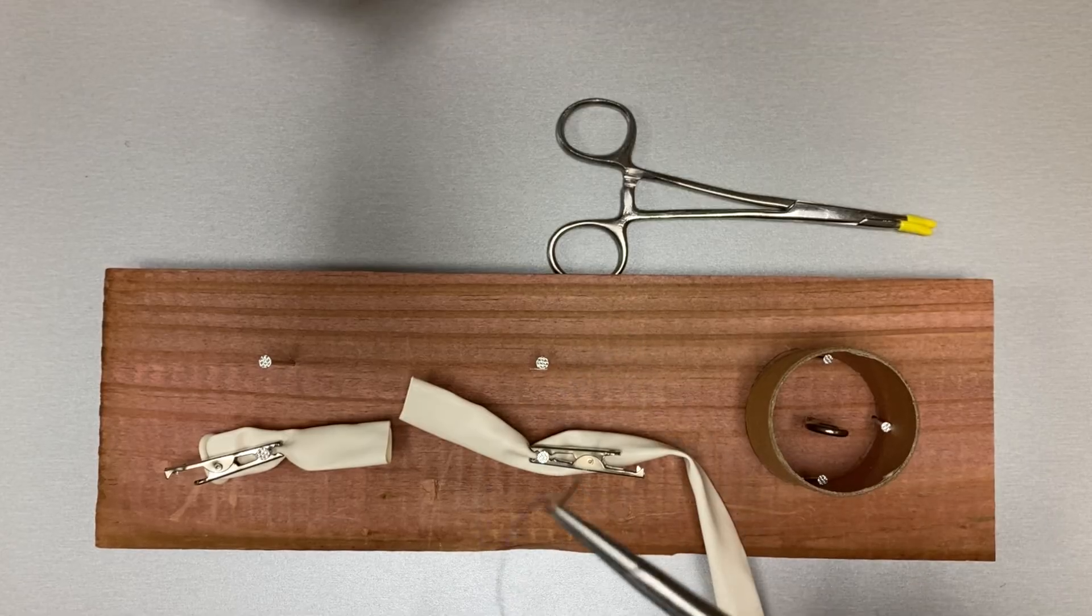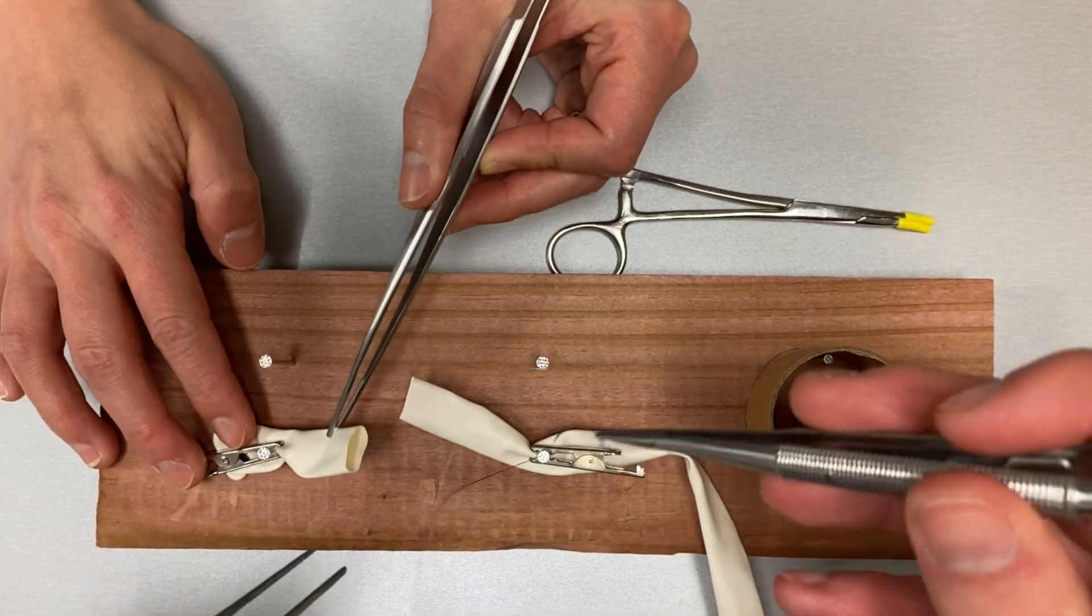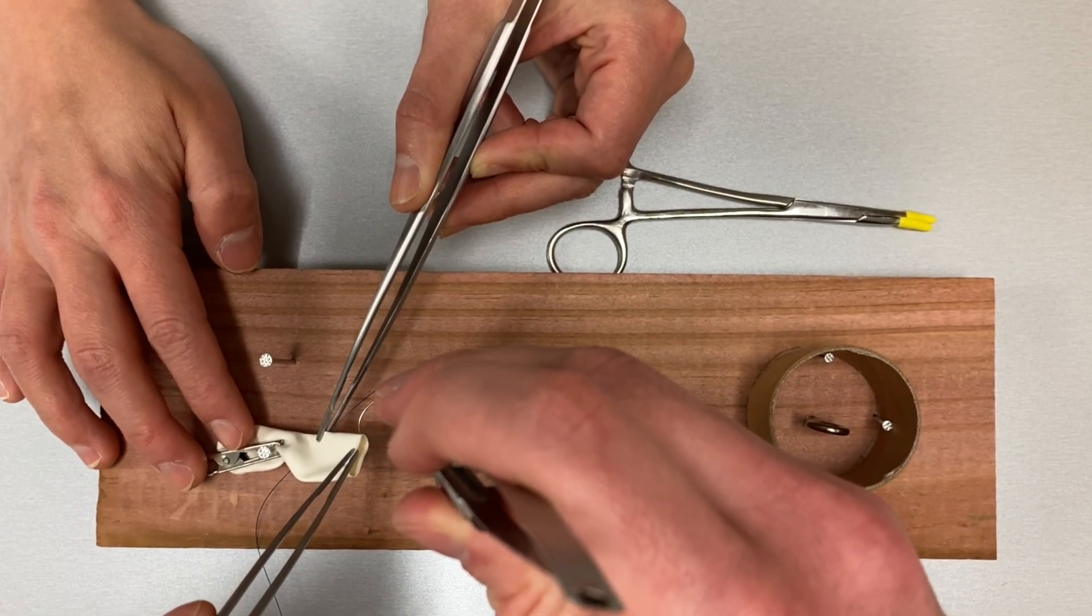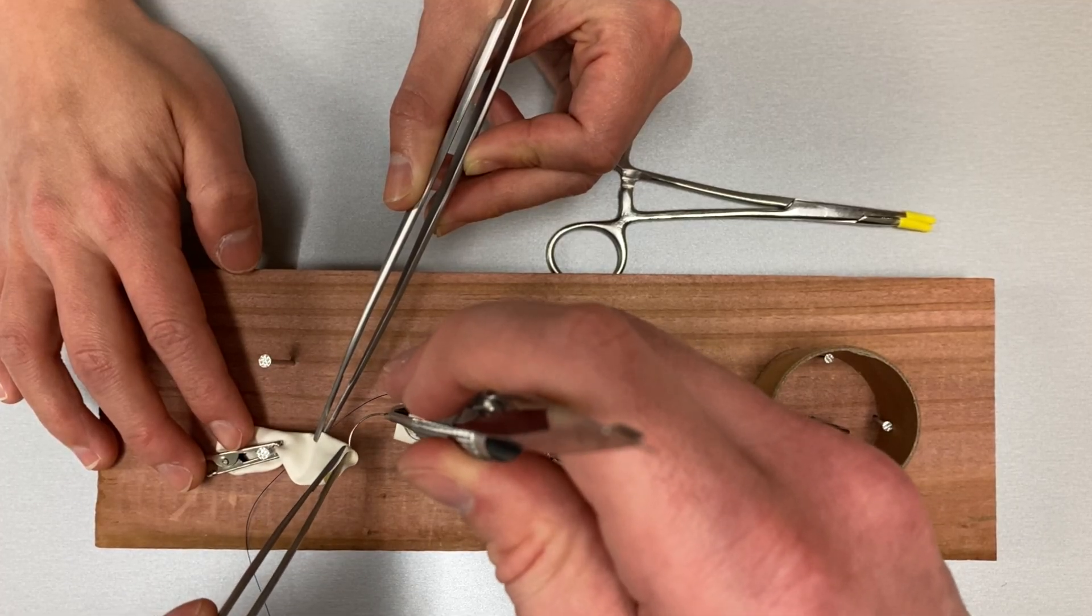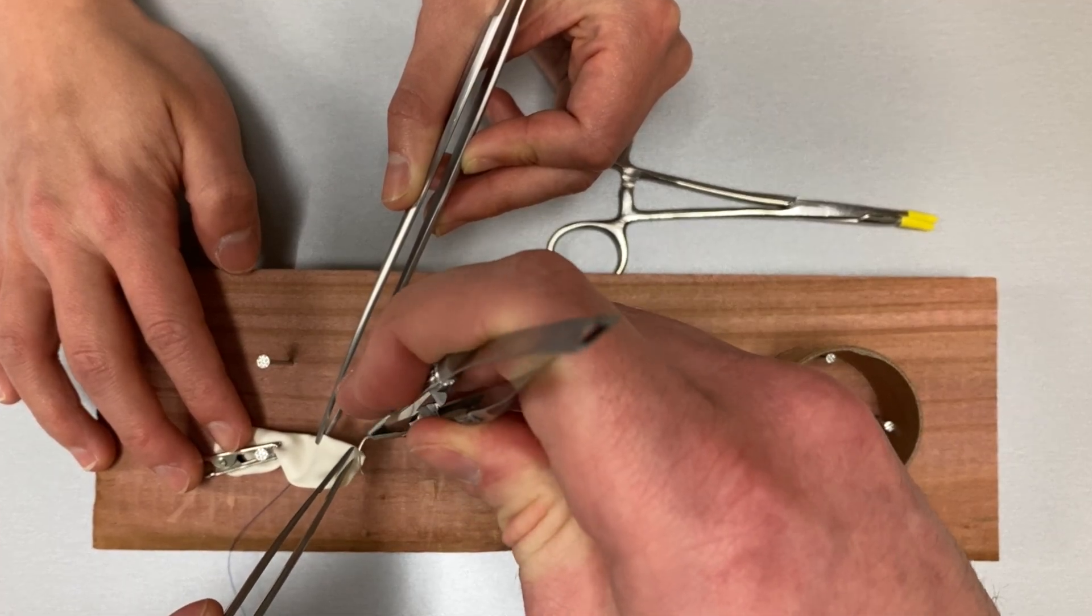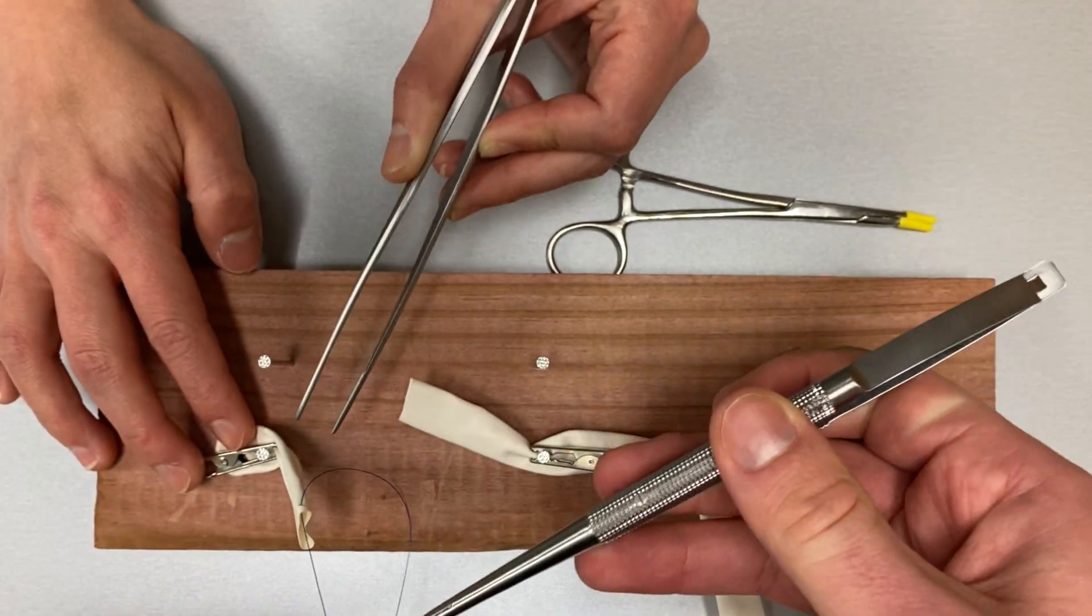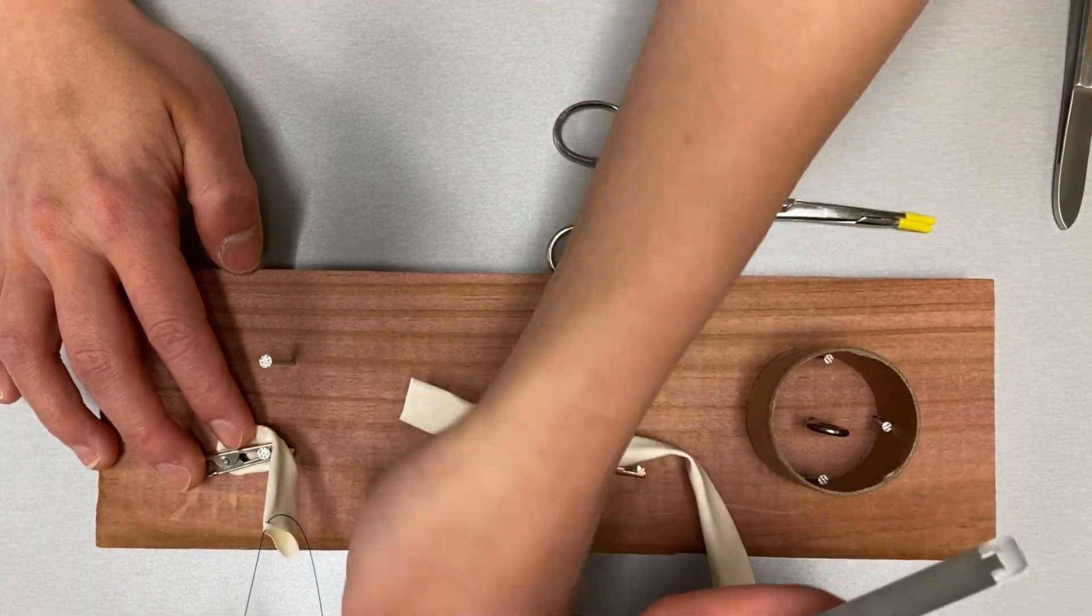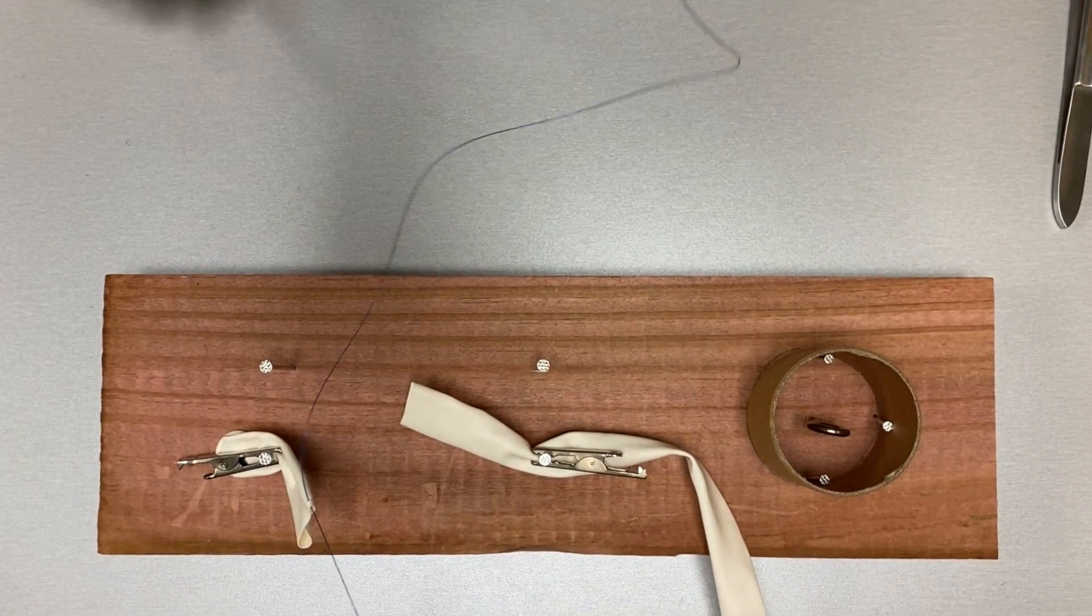Begin by loading the needle backhand. Starting with the vessel end to the operator's left, place your first suture bite at the 3 o'clock position from outside in. Reload the needle backhand, pull the suture through to half its length, and have your assistant shod the opposite tail.